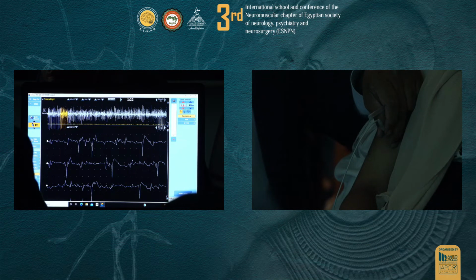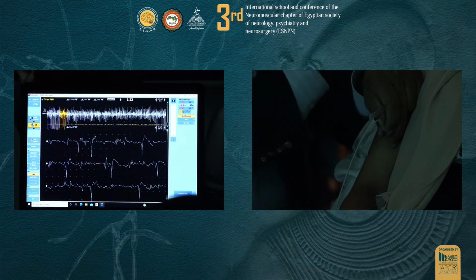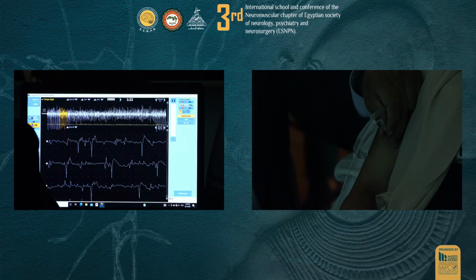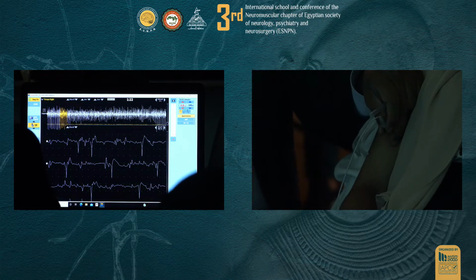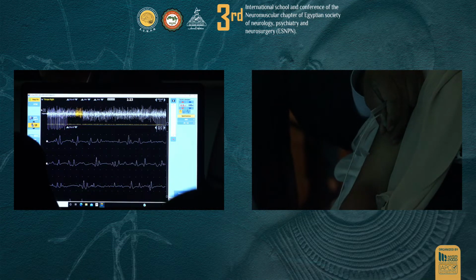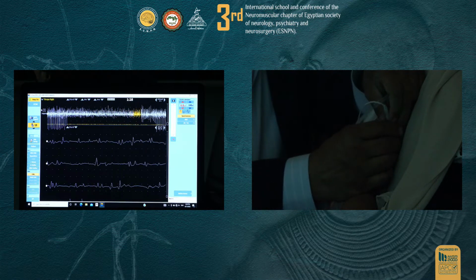I can't comment on the phases, but I can see some small motor units. I'm not sure, because they're not close to my needle because of the artifact. I would like to go close to this motor unit to see its size. It may be a distant motor unit, okay? So unless I'm next to the motor unit, I won't be able to comment on the size. I'll show you in my examples. Let's do it one more time. Okay, good. I have reduced the gain, so you can't tell me the size at this gain, okay?